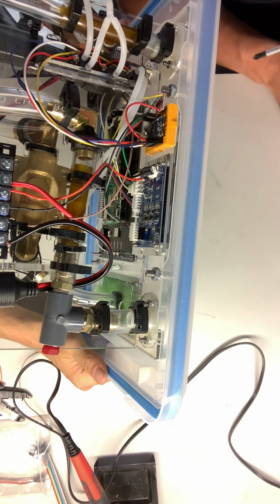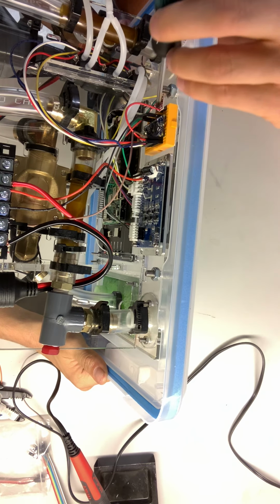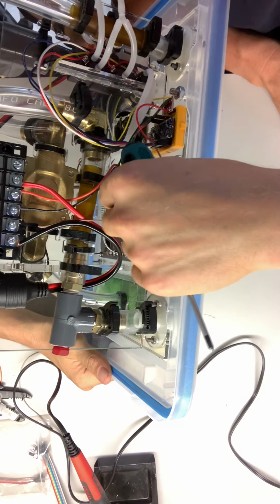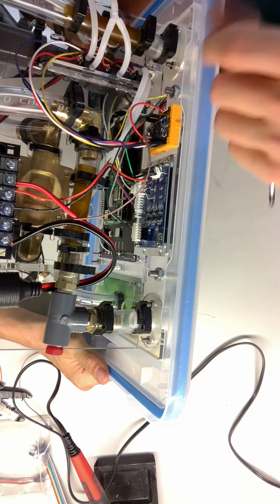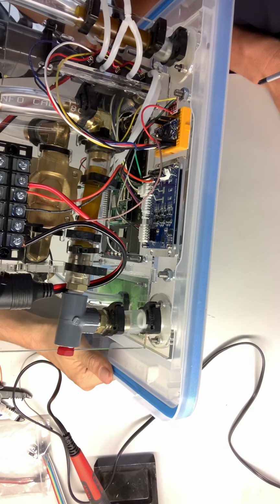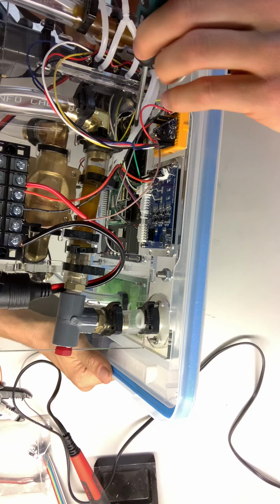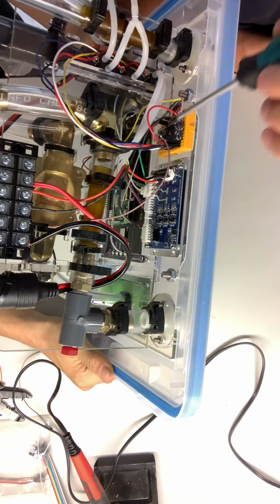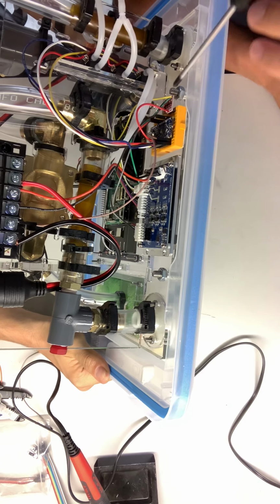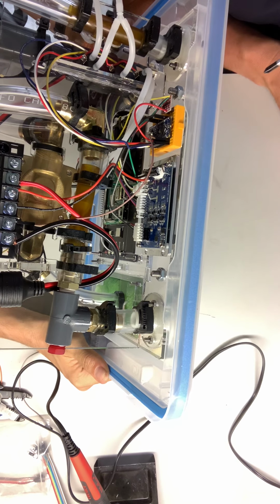Okay, so then we also have a ground path from the same ground on the level shifter up to our solenoid. Let's check that one. Where's that going? I actually don't know, I think I just threw the solenoid in randomly, which is going to be hard to get out now. The solenoid is the green Molex. Yep. Oh, it's all the way over there. I grounded the solenoid directly to ground. Yeah, sure. I don't know if you moved that pin when you put the Arduino in, or if I just left it where it was. I corrected it. Okay, you corrected it.